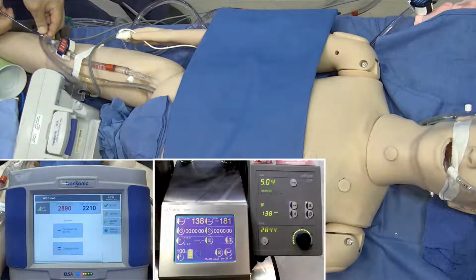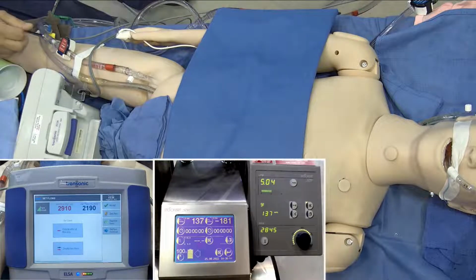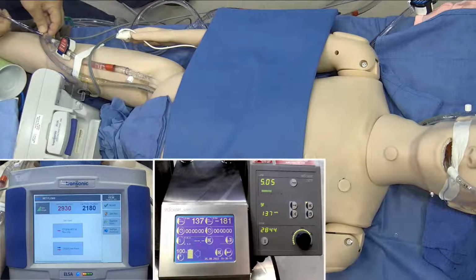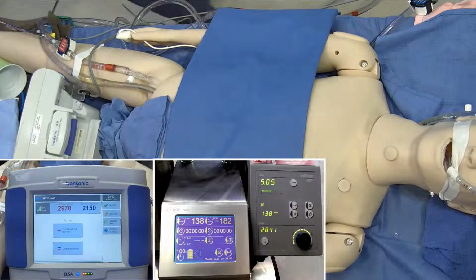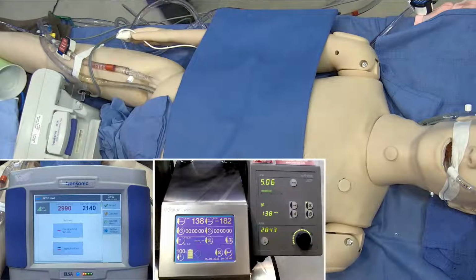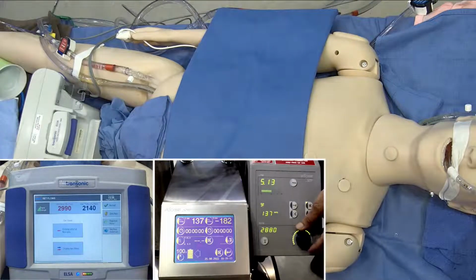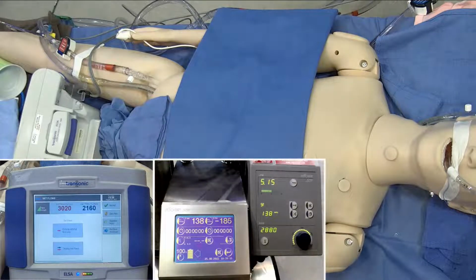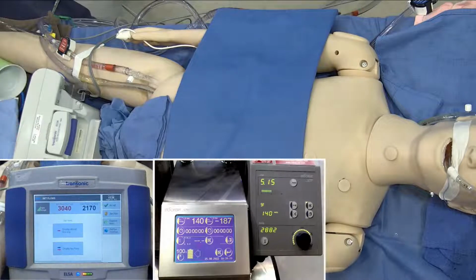And it's as simple as that. Some people use, I can't remember the name of the clamps, Hoffman clamps, I think. They're screw clamps. I don't like them. I grew up with tubing clamps, and I'm just used to doing this with tubing clamps. So if I wanted to increase this to 3 liters, I could possibly try to squeeze out a little bit more flow, see what I can get out of it, and voila, this is what you would do. Now I have 3 and 2, and hopefully this will help the patient.